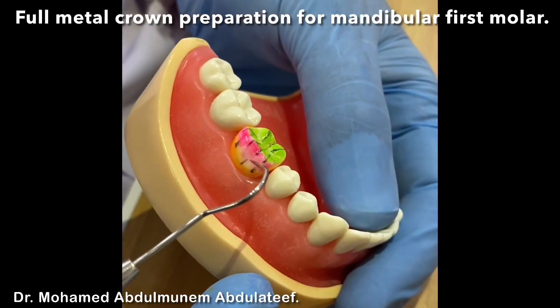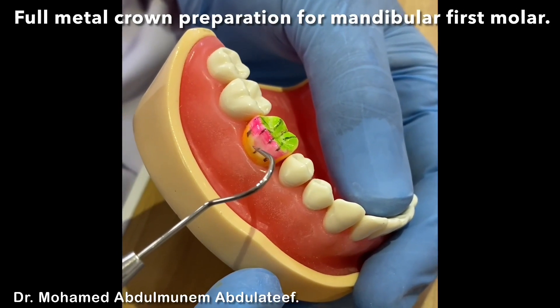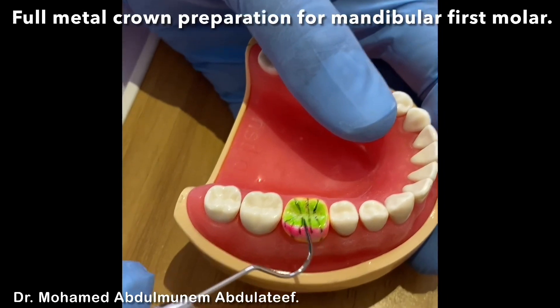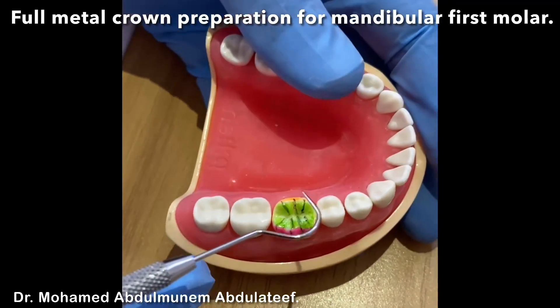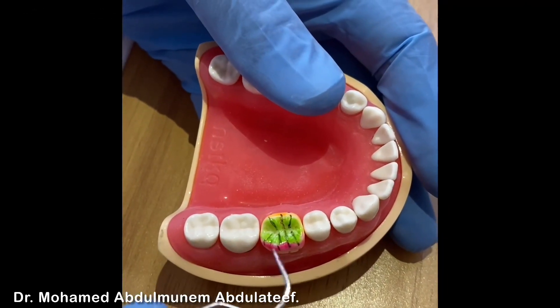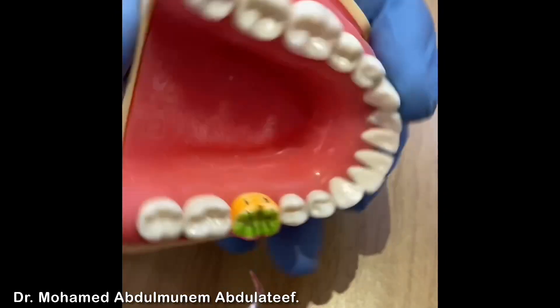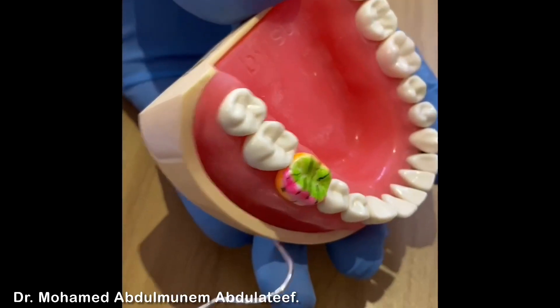The part marked in color will represent the bevel of the functional cusp. The functional cusp for lower six is the buccal cusp. Non-functional are the lingual cusp. The orange color will represent the axial wall — lingual, proximal, and buccal.